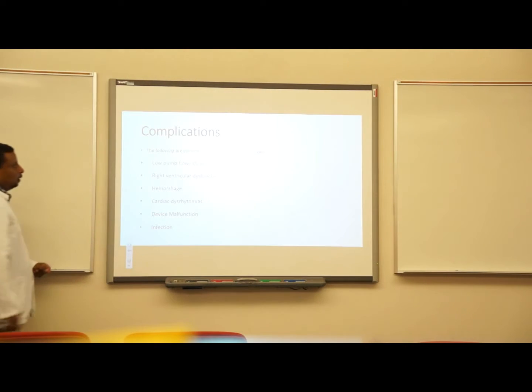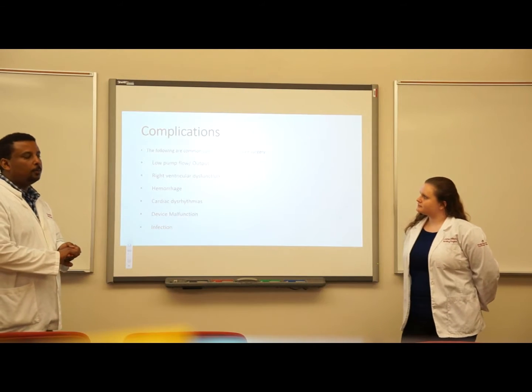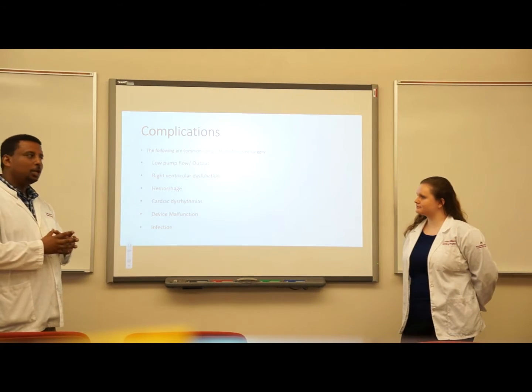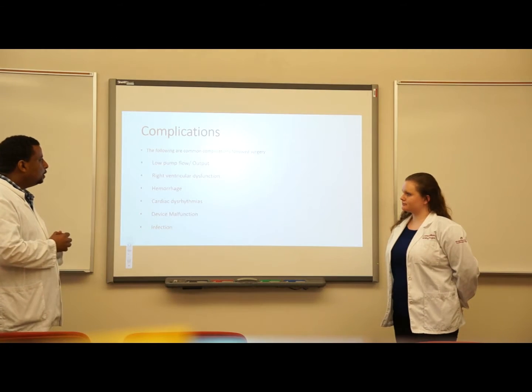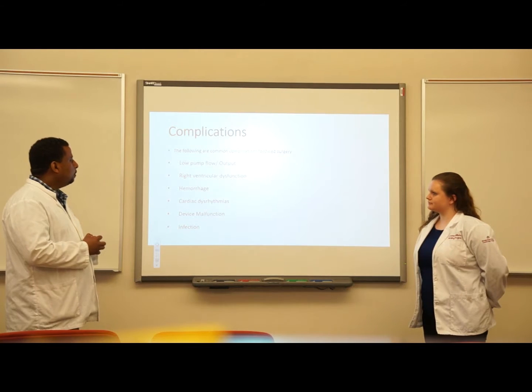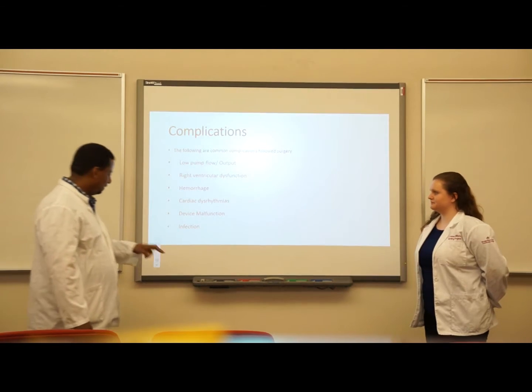All right, so we talked about the various destinations and the indications for use. And now we'll be talking about complications, especially in the post-operative time. Most of these complications are a low pump flow or output, right ventricular dysfunction, hemorrhage, cardiac dysrhythmias, device malfunction, and infection.